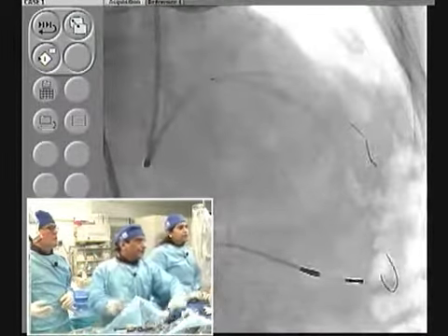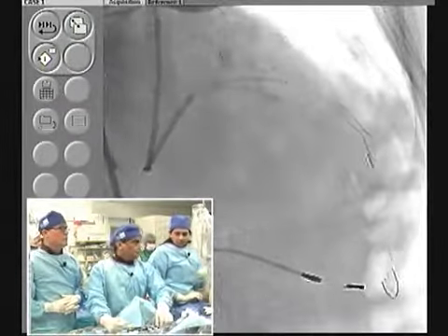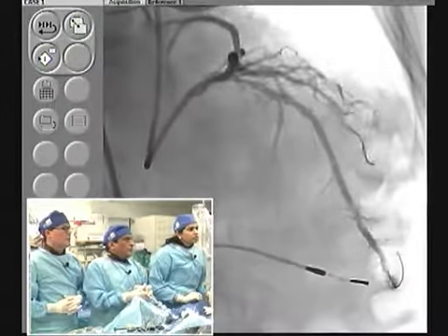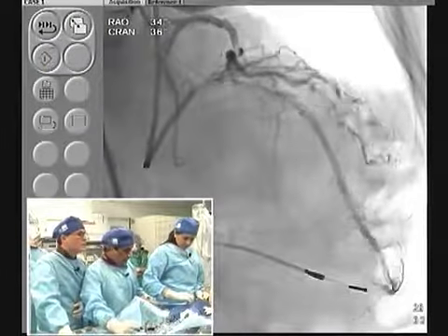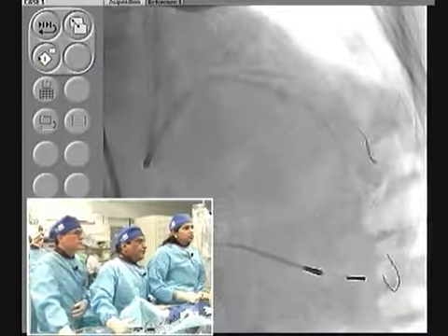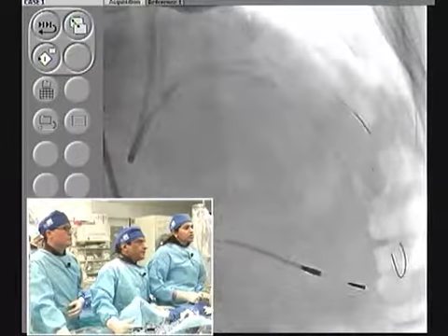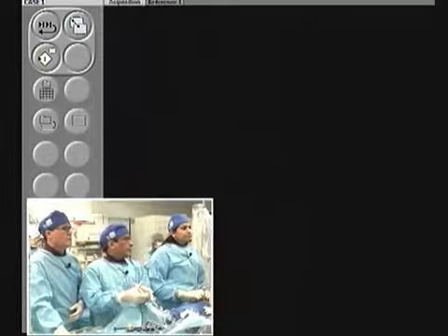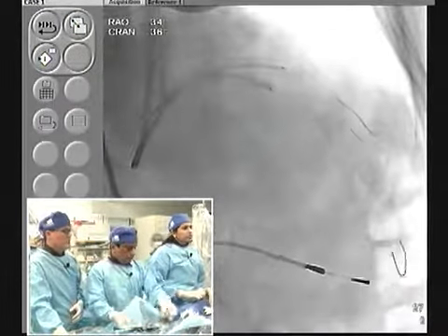Now, the question is, I still think the diagonal should go 1 millimeter in. Remember, there is a very little disparity. Can you show me some dye so I know exactly how much I have to go in? Right now the diagonal stent is in that lesion, in the mid portion of that lesion. So we just need a 1 millimeter tuning adjustment. Good, good. Hold it there. Go up.